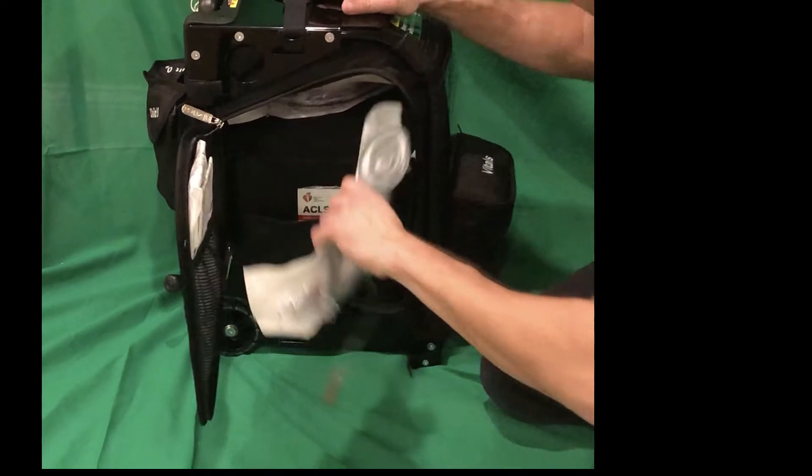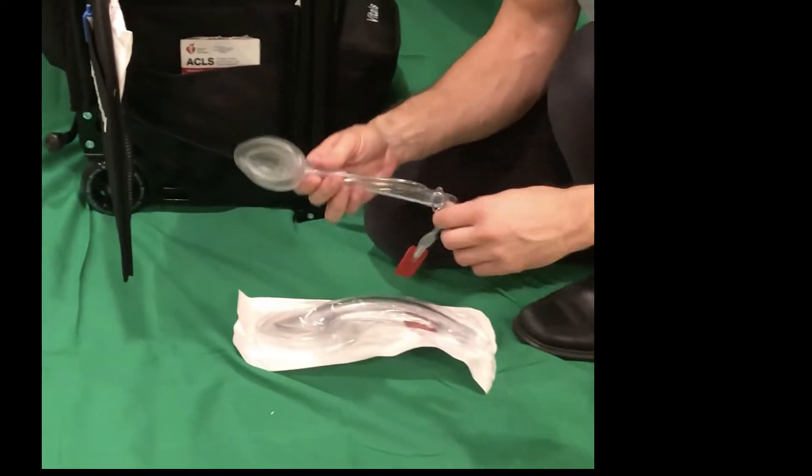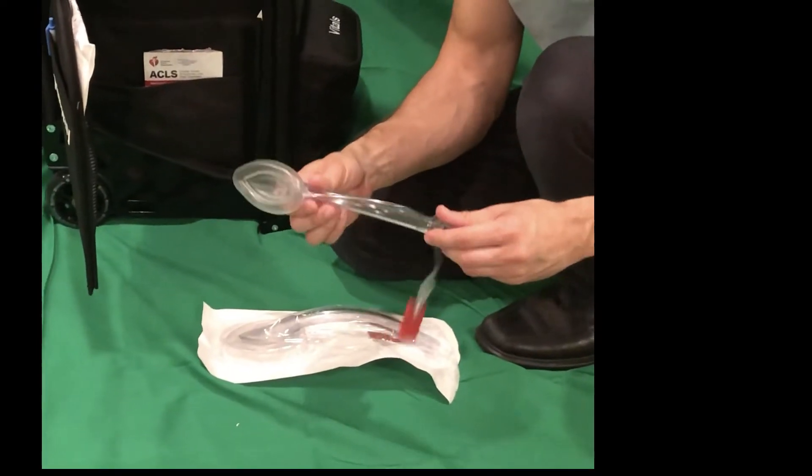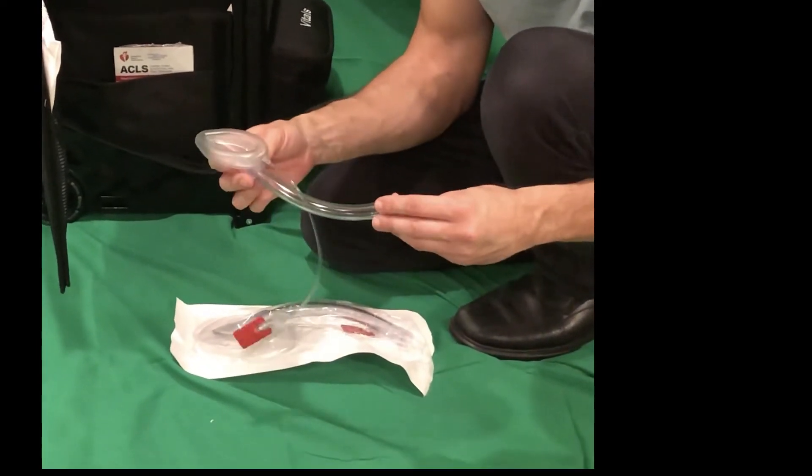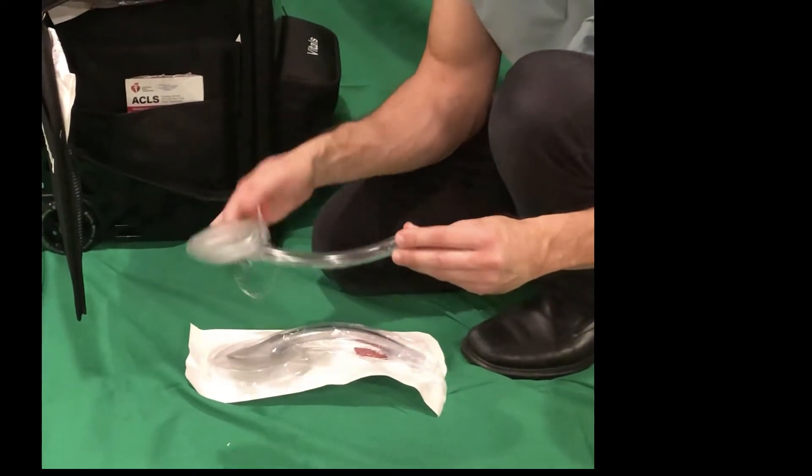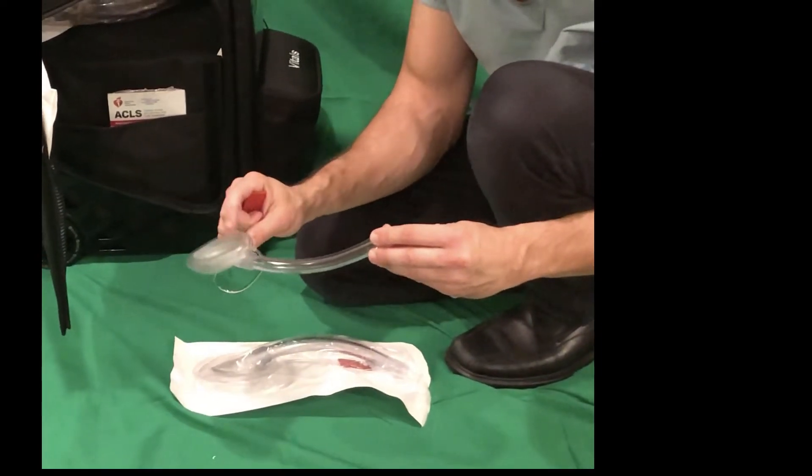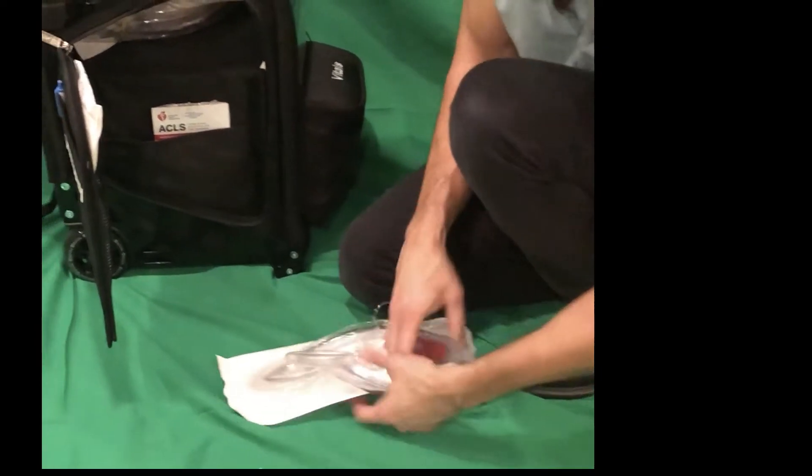Next are the LMAs. I've already got the number 4 LMA out. It's probably the most common one that we would use. We would also want to inflate this cuff to make sure that the LMA is sealed.